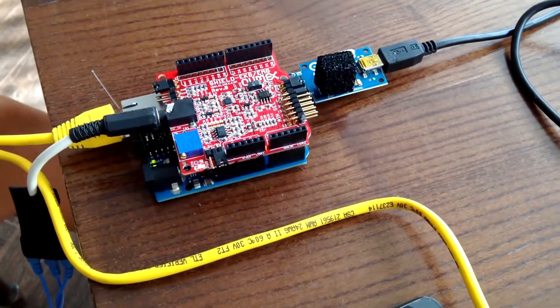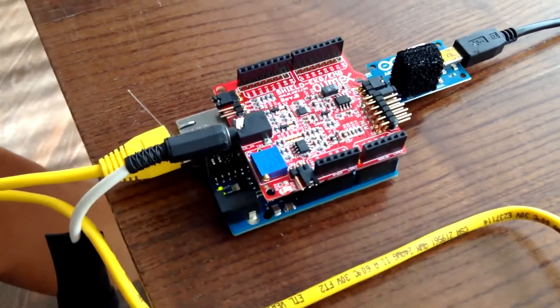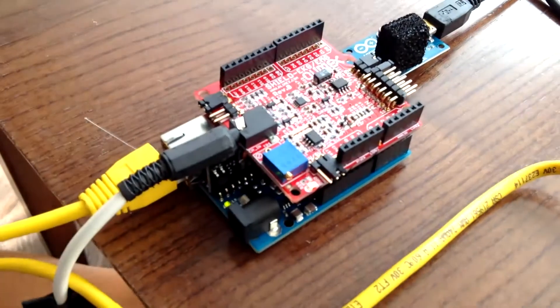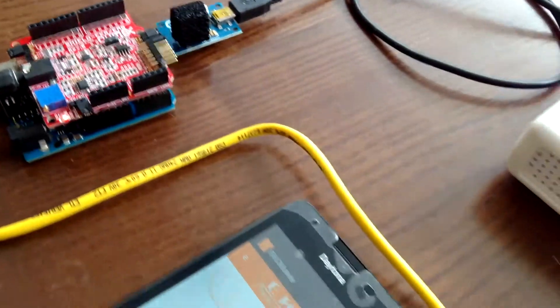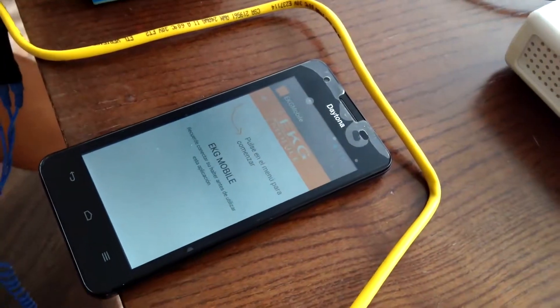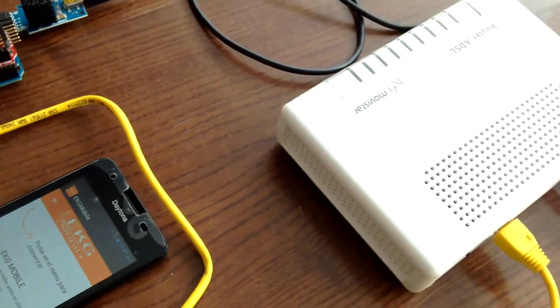The system consists of the following parts: electrodes properly attached to the patient, an electronic board, a router, and a smartphone.